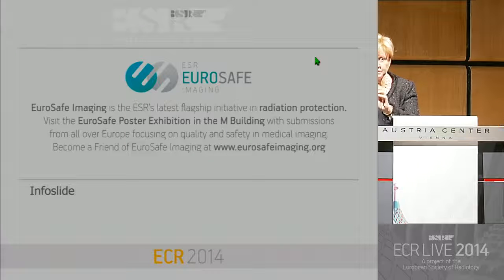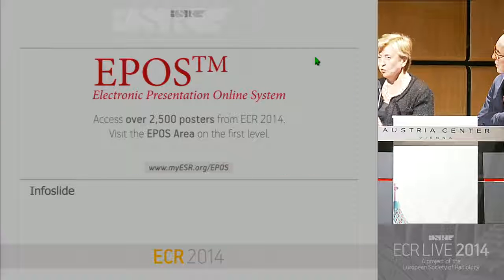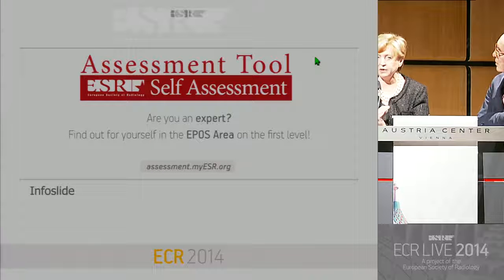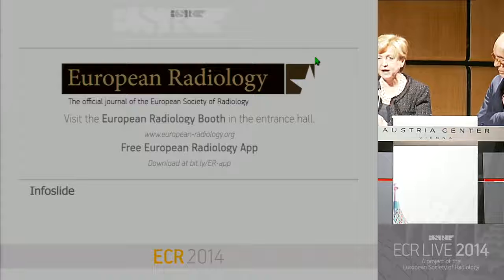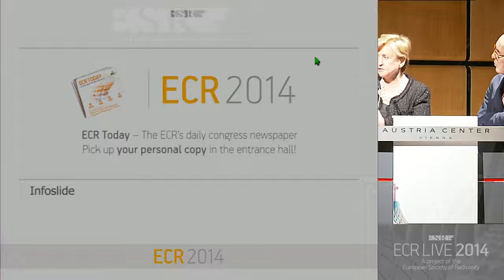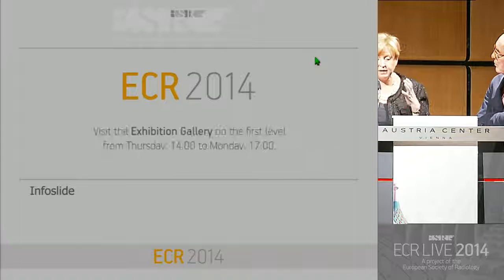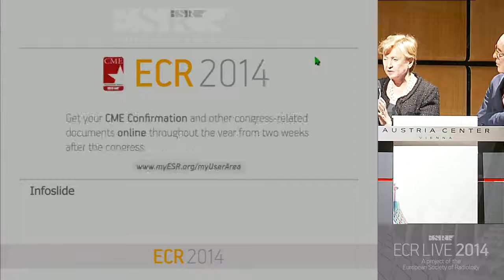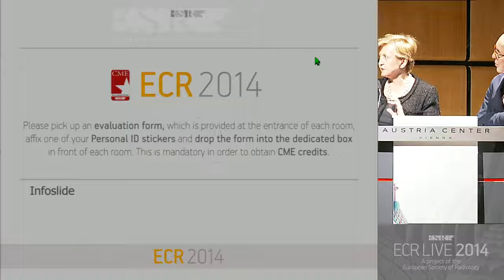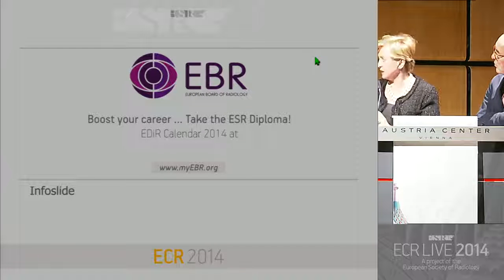I am sorry if I wasn't clear on active surveillance. We never said that we replace the biopsy. We do MRI in the active surveillance group because we know, and it was published, that biopsy can miss lesions. A patient goes on active surveillance based on the clinical parameters that you showed, PSA, cores, and so on, and based on biopsy that's already done.